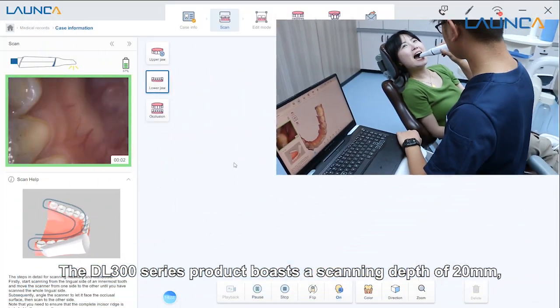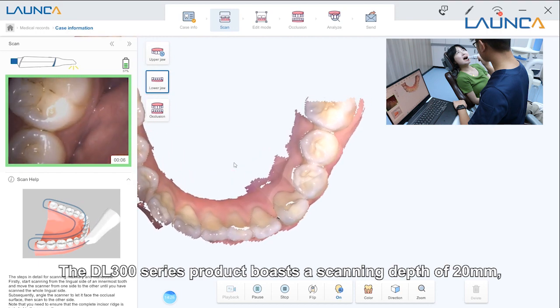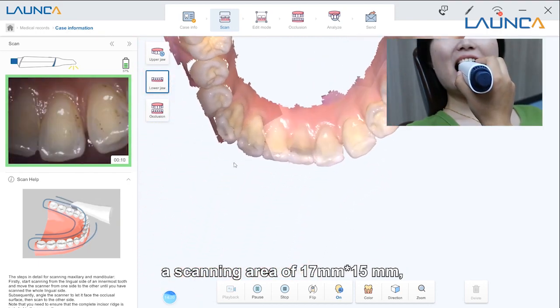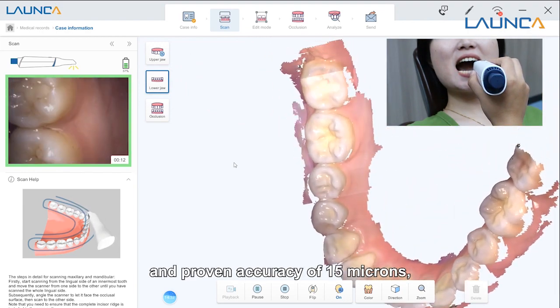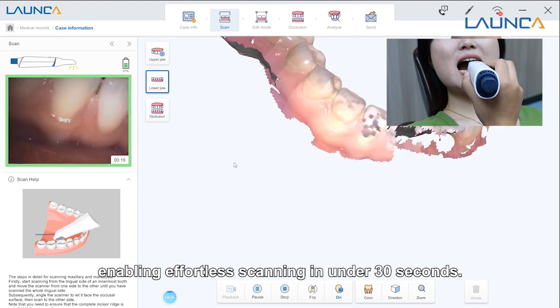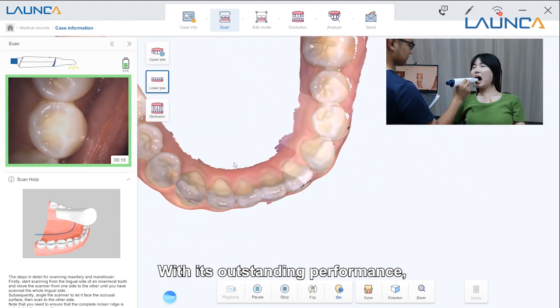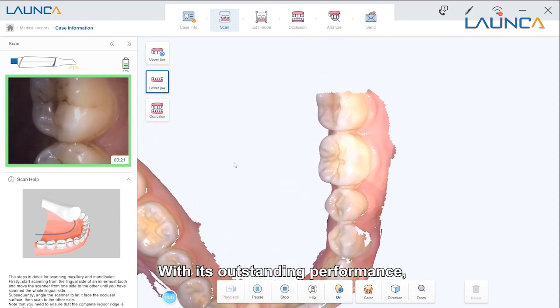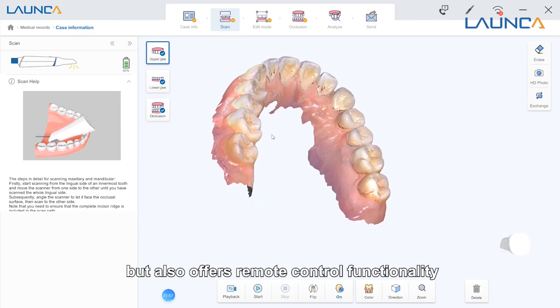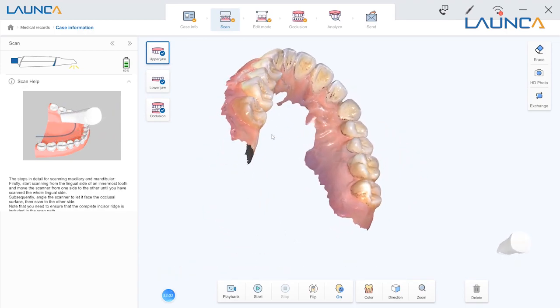The DL300 series boasts a scanning depth of 20mm, a scanning area of 17mm by 15mm, and a proven accuracy of 15 microns, enabling effortless scanning in under 30 seconds. With its outstanding performance, it not only ensures efficient scanning, but also offers remote control functionality to view your scan models easily.